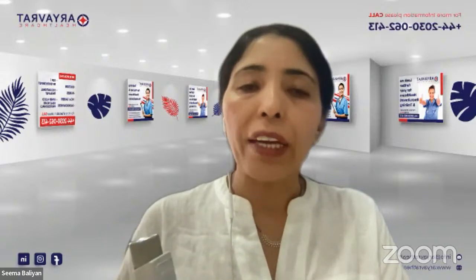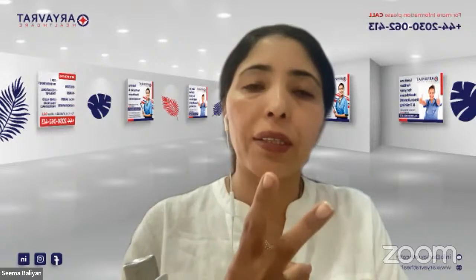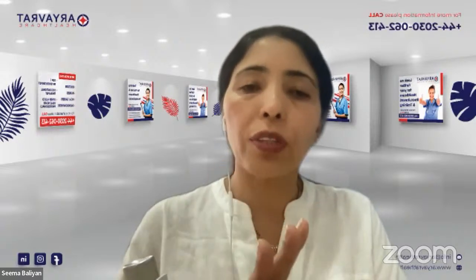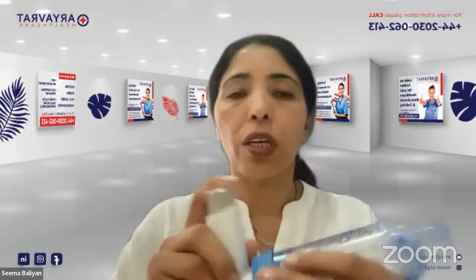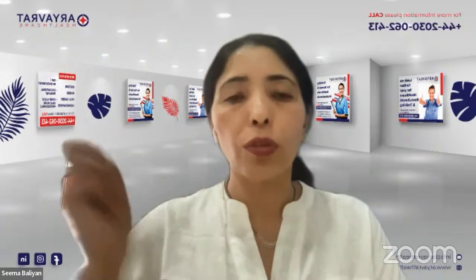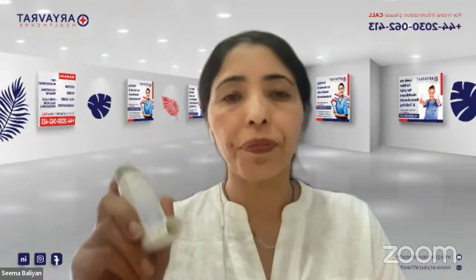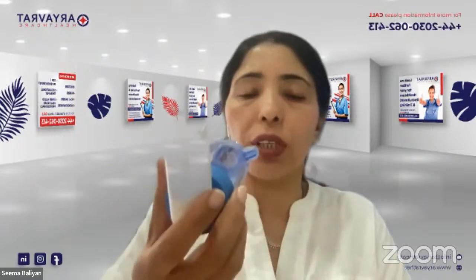You are going to wait for 30 to 60 seconds between two puffs of the same medicine. So you are going to wait for some time, around 30 seconds. You are going to take your inhaler out again, and again shake it for 2 to 5 seconds. Then you are going to insert it and repeat the same procedure again.